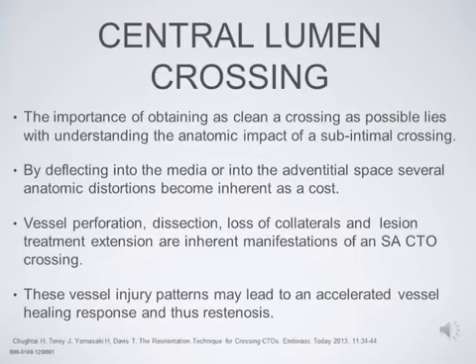Vessel perforations, dissections, loss of collaterals, and certainly the lesion treatment extension are inherent manifestations of adventitial crossing in all CTOs. And these vessel injury patterns that we're talking about certainly can accelerate vessel healing in the adventitial, turning on cellular milieu that can cause restenosis.